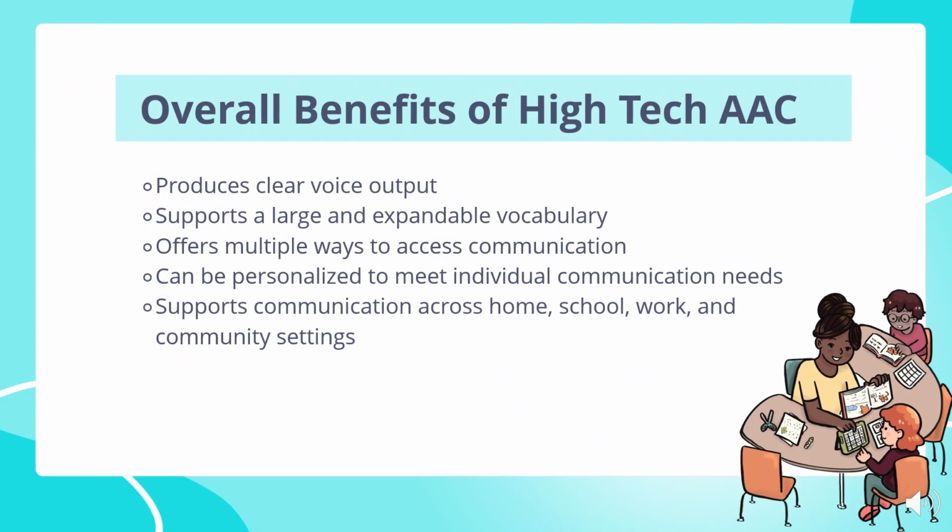High Tech AAC devices offer several important benefits. One of the primary benefits is that they can provide clear voice output while supporting large, expandable vocabularies that can continue growing with the individual. Many systems also offer multiple access methods, allowing communication to be matched to a person's motor abilities. Because these devices are highly customizable, they can support communication in many different settings such as home, school, work, the community, and healthcare settings. By providing flexible communication options, High Tech AAC can increase participation, independence, and opportunities for meaningful interaction.